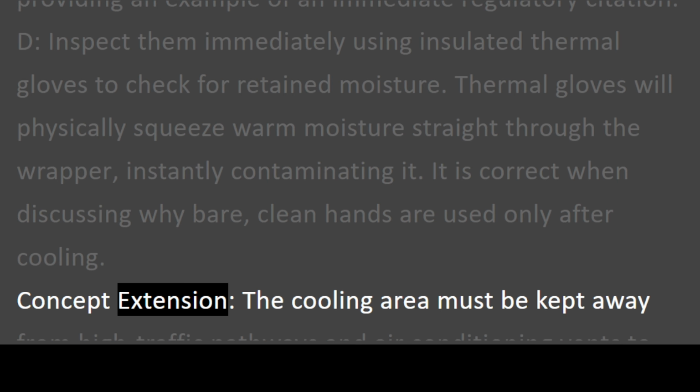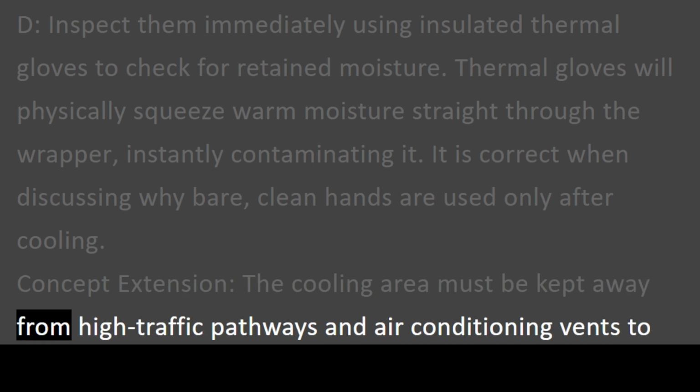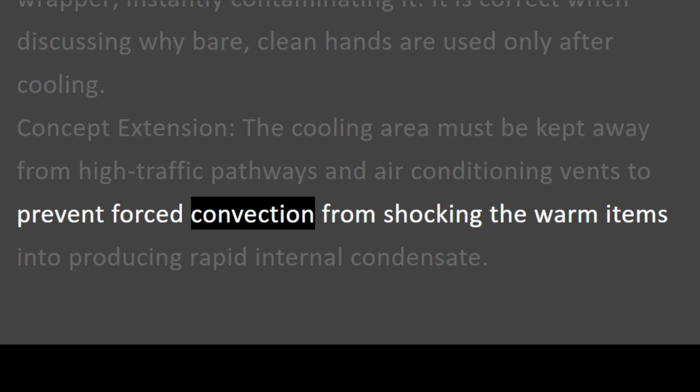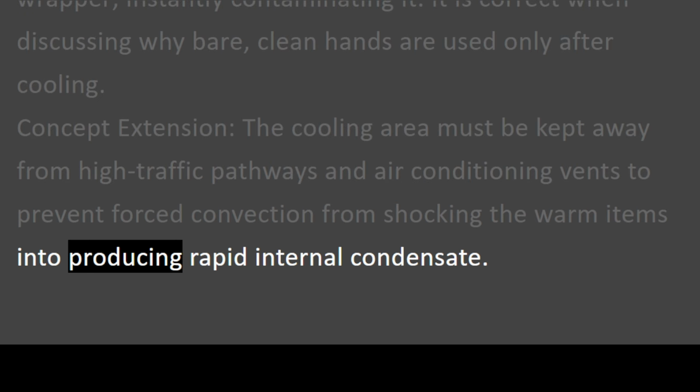Concept extension: the cooling area must be kept away from high-traffic pathways and air conditioning vents to prevent forced convection from shocking the warm items into producing rapid internal condensate.